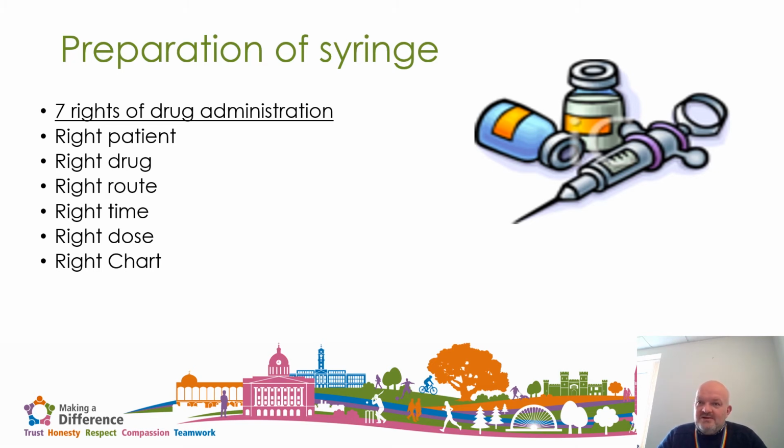There have been instances in the past where one driver has been changed with the wrong medication. So when it was checked, the patient had 2 syringe drivers running with the same medication in each pump. So in order to make sure that doesn't occur, that simple idea of a red sticker on one chart, a blue on the other, and then corresponding red and blue stickers on the line and again on the actual syringe.